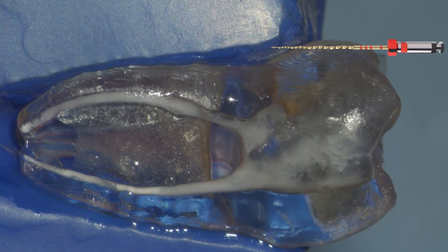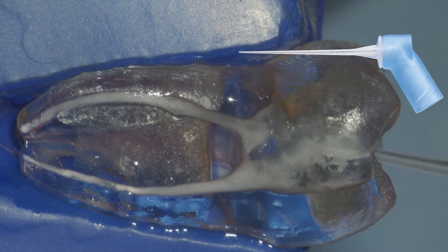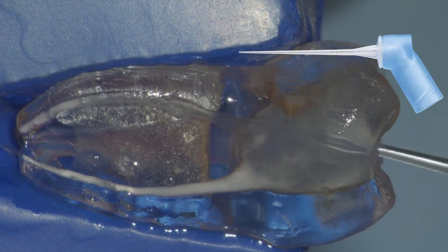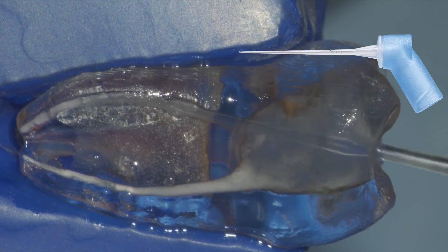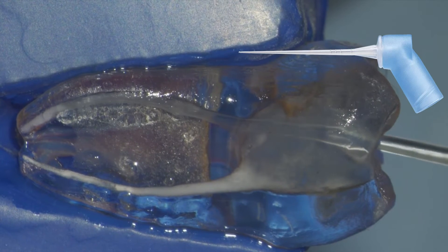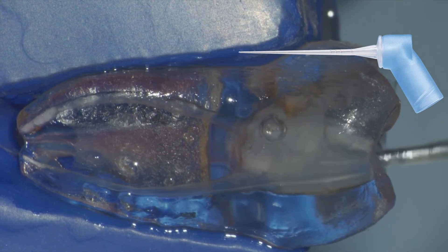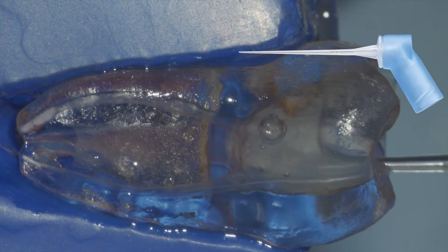In certain cases where you have a small radius with a great angle, you want to evaluate whether you can complete shaping with the prime instrument or drop down to the size 20. Remember, once you use the 20, you're creating a more predictable glide path at a larger size, and the prime will probably follow over 95% of the time.